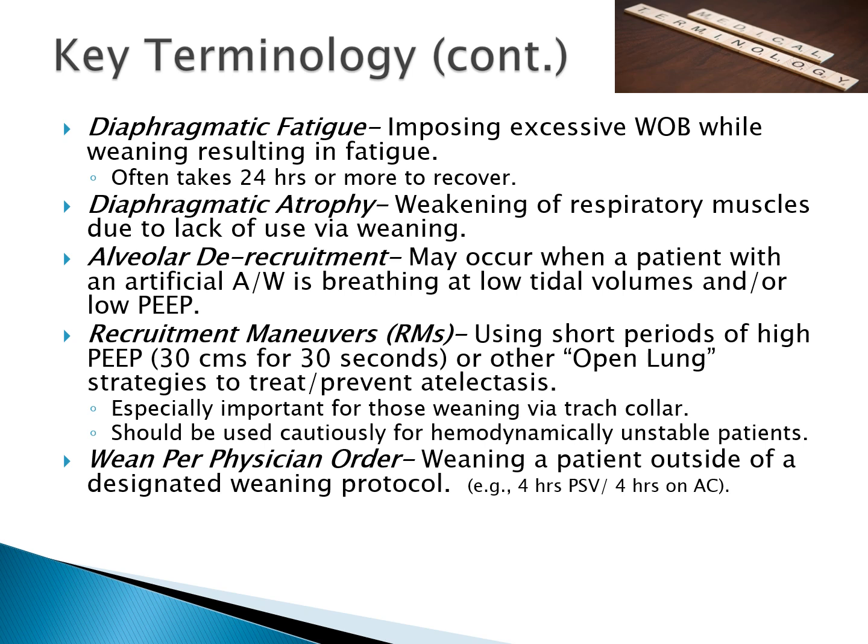There are other techniques as well. There's actually recruitment maneuvers where you use only intermittent APRV, where you use basically 7 or 7.5 seconds at a P high of, let's say, 30 or 35, and then an equal 7.5 seconds at P low. So that's not APRV. Obviously, the P low and the T low is very short, often about half a second. But when you're using APRV for a recruitment maneuver, your T high and your T low are equal, but you're only doing it for about 5 minutes as tolerated.